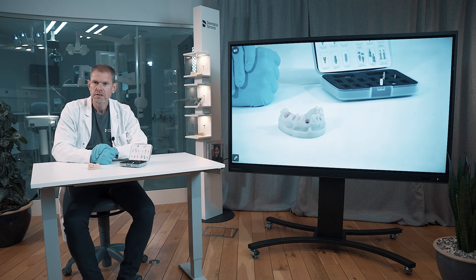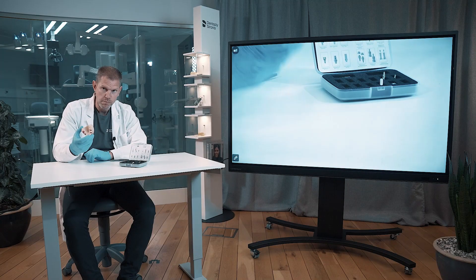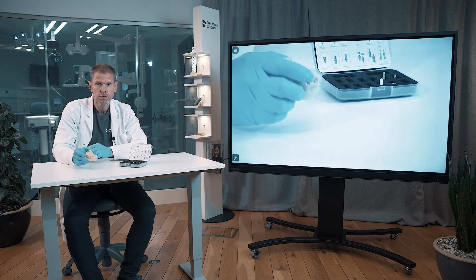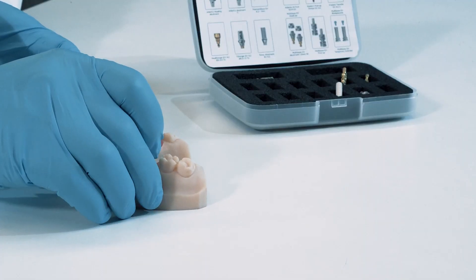Welcome to the restorative hands-on for the prosthetics for the DS implants. What you see here in front of me is the new model for the systems and the restorative parts.